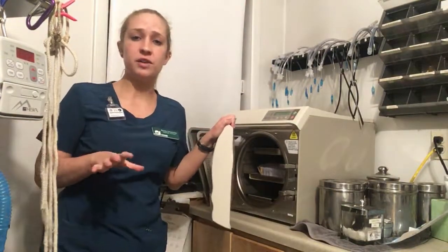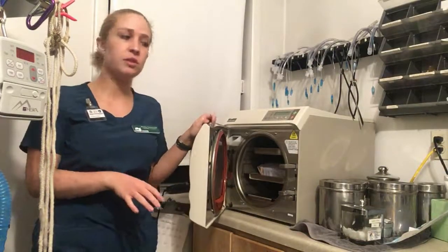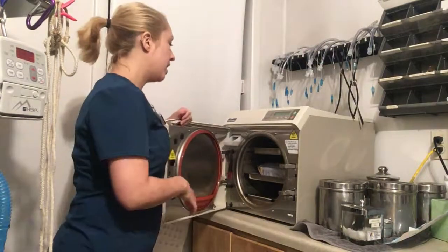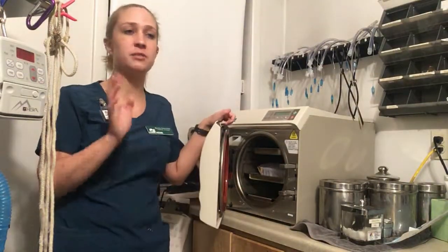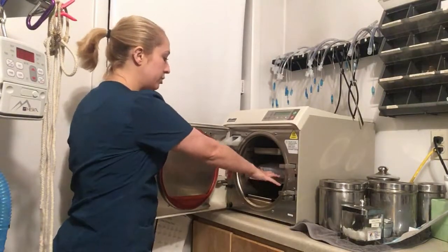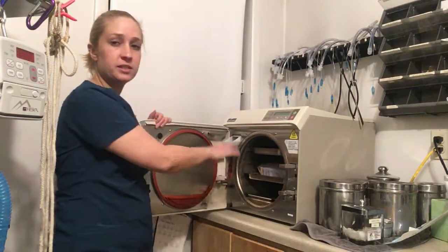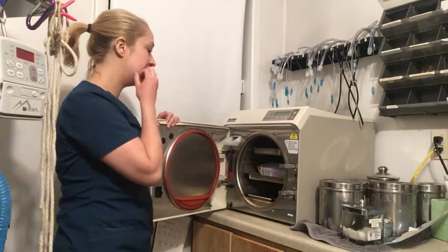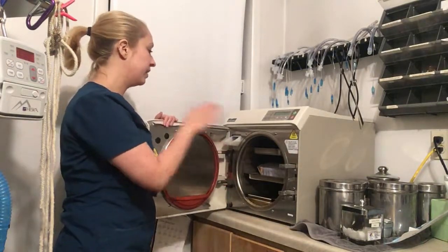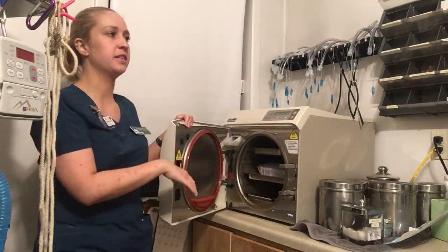Another big part of the autoclave is maintaining the sterility, and just maintaining the autoclave in general to make sure that everything is getting as sterile as possible when it is in use. For this one, it includes weekly and monthly cleanings. The weekly cleanings require you to take out each part of the autoclave, dump out all of this distilled water and replace it with fresh, clean distilled water. You're going to take speed cleaner, anything like that, and some water, and just wipe everything down. You're going to clean up the filters, things like that.